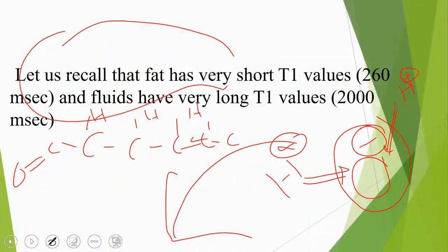As a result of the small water molecules moving extremely quickly, there is a significant mismatch in the resonance speed of the protons present in the water compared to the surrounding medium, causing the energy transfer to take more time than expected. This is why water takes a long time in the process of recovery.